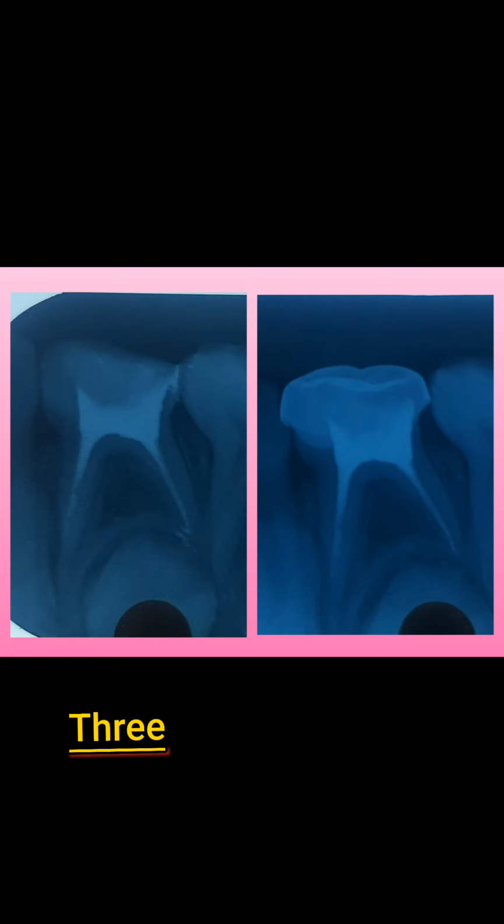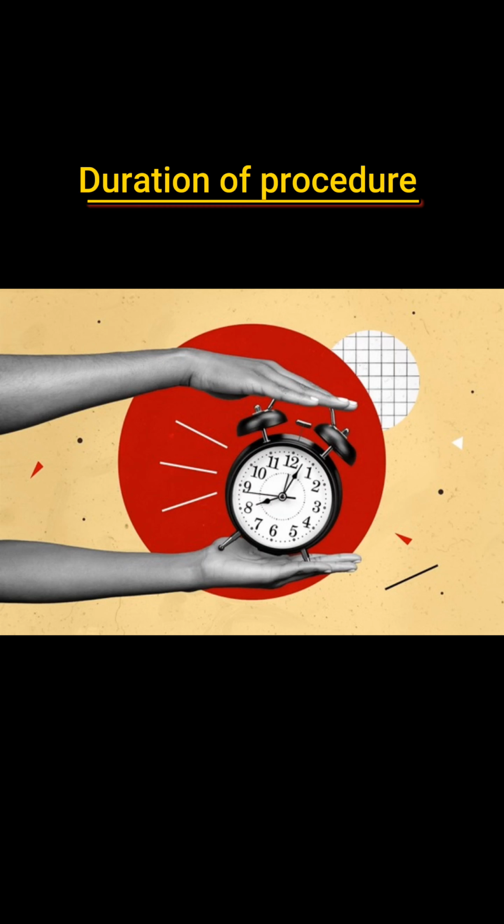understanding. The patient had deep decay in the milk tooth, so I removed the decay and unsupported tooth structure from the top and measured the length of the roots with my instruments, and cleaned it thoroughly and filled the empty space with the special material and sealed it with a good quality filling material, followed by which I placed the cap on the tooth for the extra strength. So this procedure might take single or multiple visits depending on the infection and patient's cooperation.